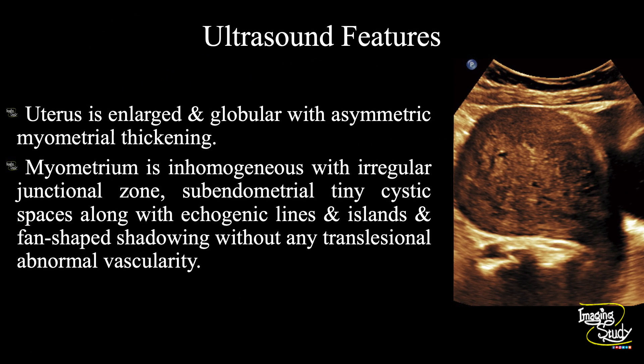In summary: an enlarged globular uterus is seen with asymmetric thickening of the myometrium. The myometrium is inhomogeneous with an irregular junctional zone, sub-endometrial tiny cystic spaces, along with echogenic lines and islands with fan-shaped shadowing, and without any abnormal vascularity on Doppler. These features concluded as a case of adenomyosis.